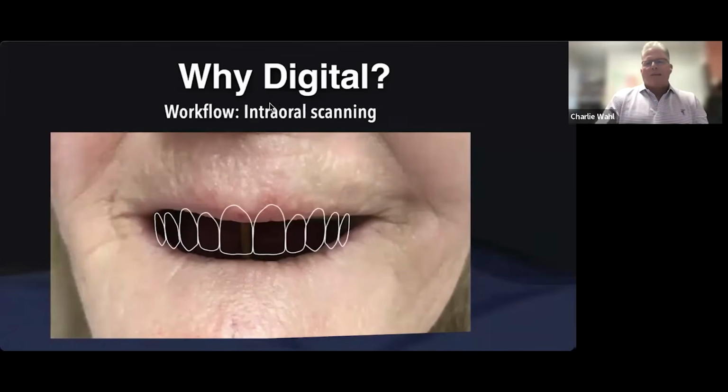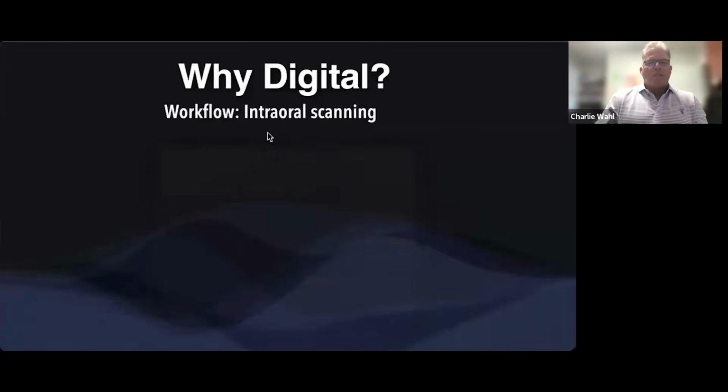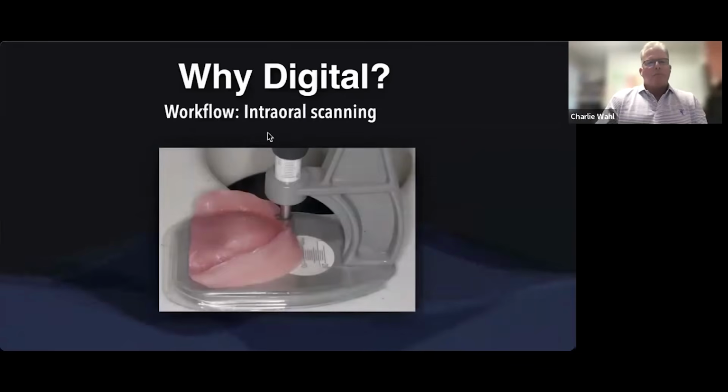I don't know. And I can make good assumptions, especially if I were to make a wax rim, right? Now I can mold this wax rim and really define exactly where my tooth position is. But if I choose to just do edentulous scanning and I want to skip a step, there are some tools to give me a guide.